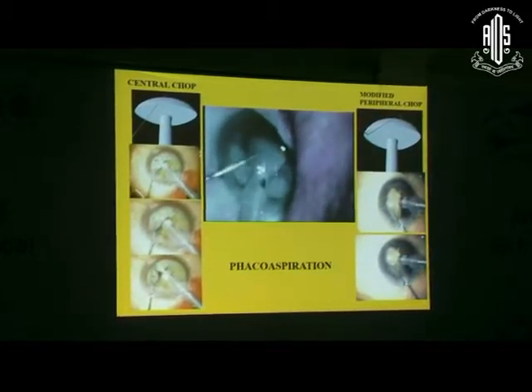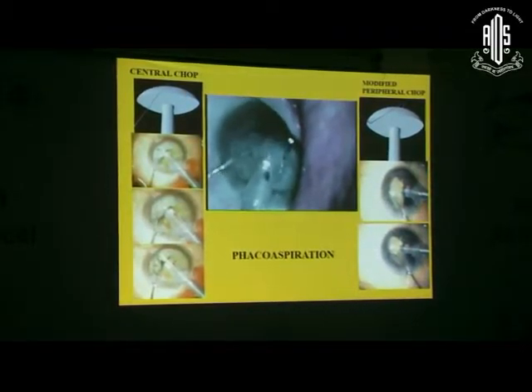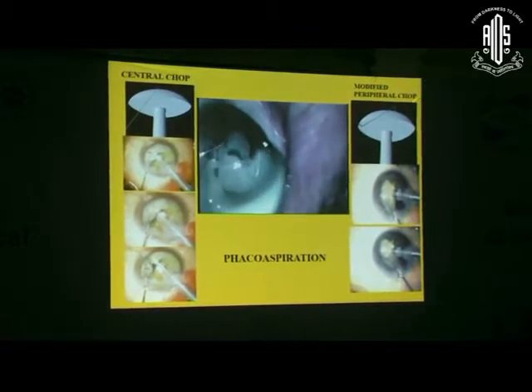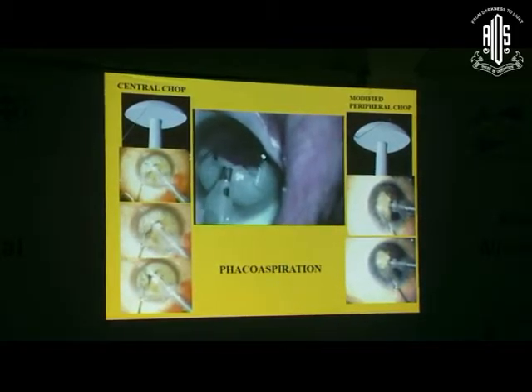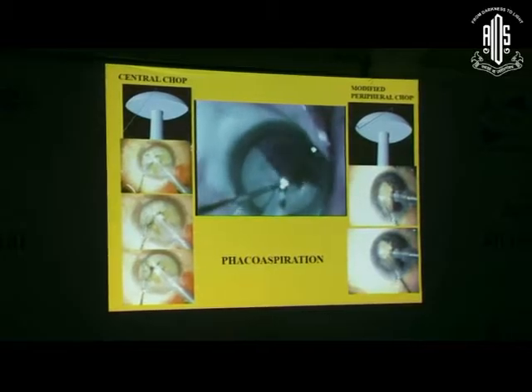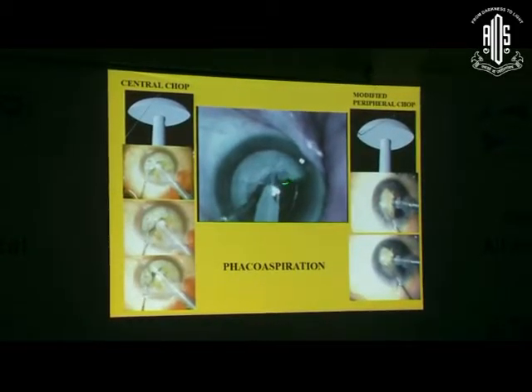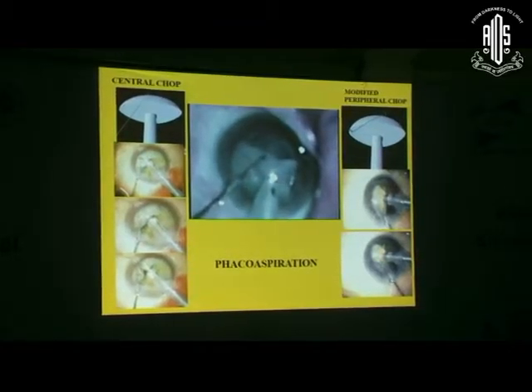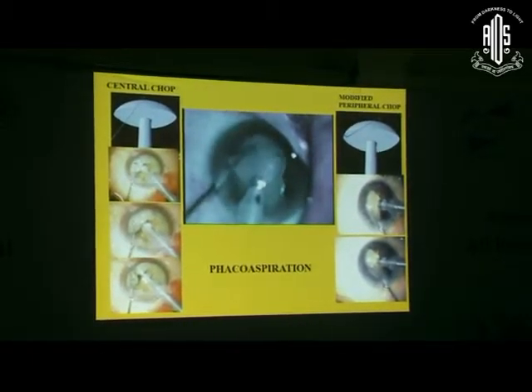There will be no chance of tumbling and pushing the posterior capsule behind. You can keep on splitting, repositioning two or three times. Even in a very hard and leathery cataract you might need to reposition your phaco tip if it was too superficially placed. Now I'll show the modified peripheral chop - instead of negotiating the chopper underneath the rhexis margin, I pull the periphery of the nucleus out of the rhexis margin, so I can start chopping from the periphery without the cumbersome procedure of negotiating underneath the rhexis. This is very comfortable in the second half of a large nucleus. Vacuum seal created, pull the periphery out, go to the periphery and chop - it splits far more easily in one go compared to central chop.